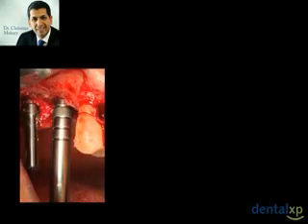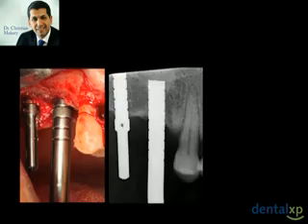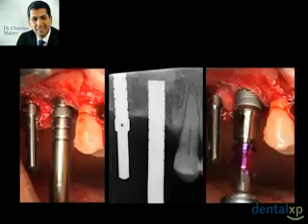So what we do clinically is, after we make an initial preparation of the implant sites below the sinus without reaching the bony sinus floor, we use an osteotome, as we can see in the radiograph what happens clinically. We tap until we break that sinus floor, and then by adding some biomaterial, we start tapping the biomaterial also, and this will allow us to elevate the sinus membrane and perform the placement of the first implant in this case.